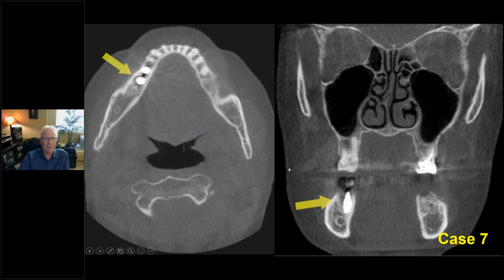And this is a different implant, patient's right. You will get dark areas between the implants if there's a couple close together, but this is artifact, okay? This is basically loss of the signal in between as the machine rotates around. And so you don't get full fill-in of that tissue. If you see radiolucency that's not between them, that's adjacent on any of the other surfaces, that is peri-implantitis.